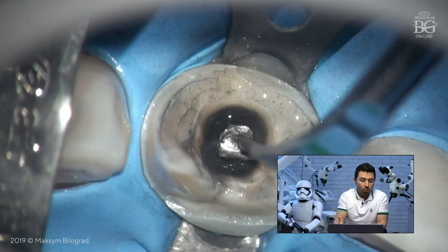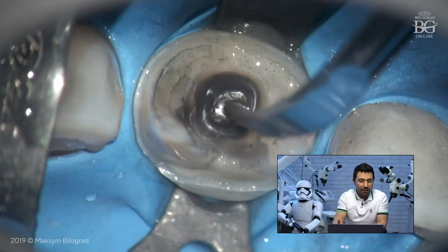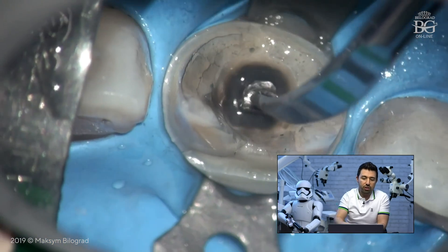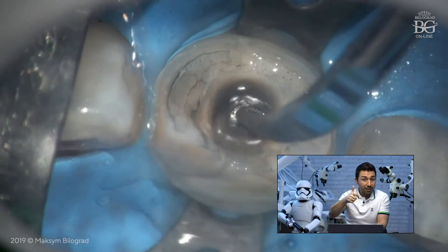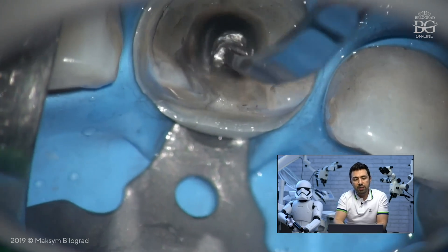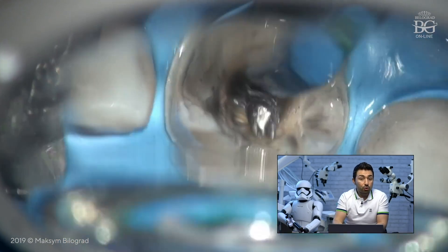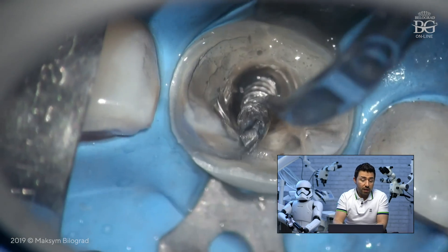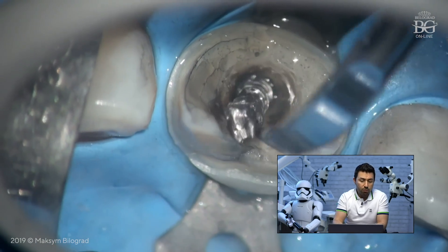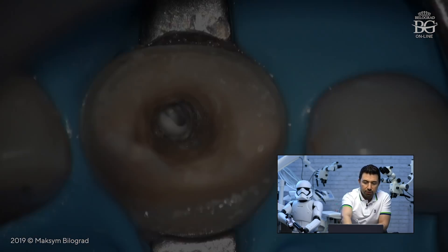I took a normal ultrasonic tip used for calculus removal in dental hygiene, and I went in with no water — using only an air spray from the assistant, and water spray from the assistant when needed. Within a few minutes, the metal post was removed and I continued with root canal treatment.